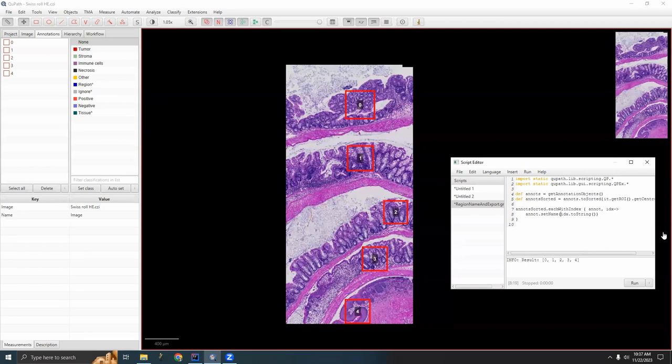I want to just change a couple of things. First, I don't want them to just have a single number. I want them to have some words in there too. So I'm going to call them region. And I don't want it to start at 0. I want it to start at 1. So I'm going to reference idx plus 1. Very nice. Now we've got region 1, region 2, region 3, region 4, region 5.